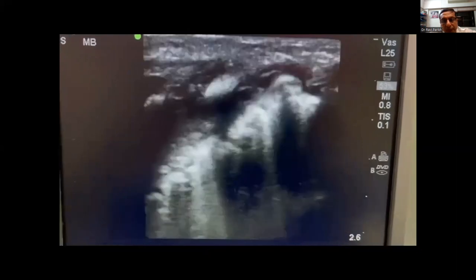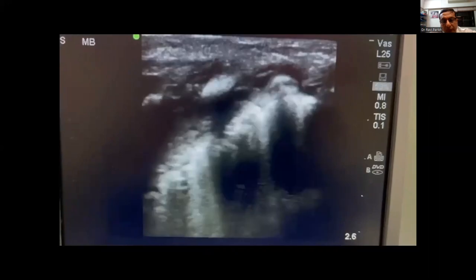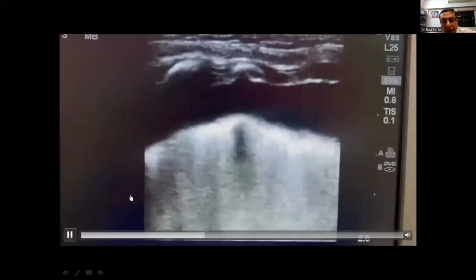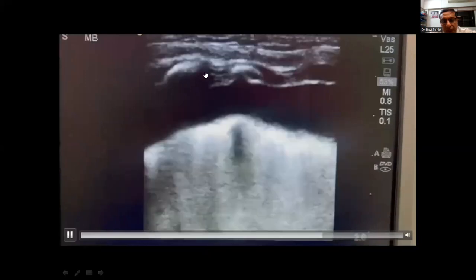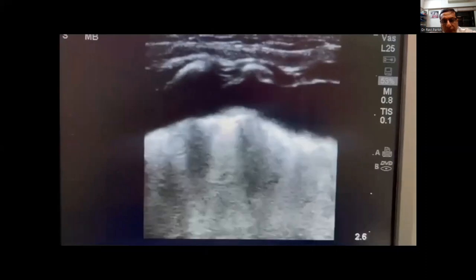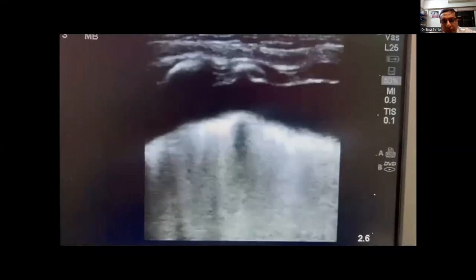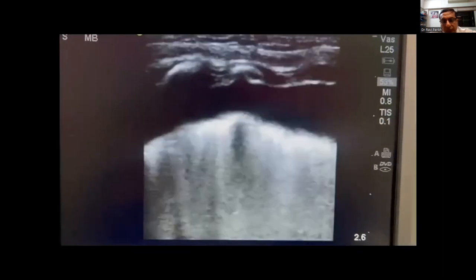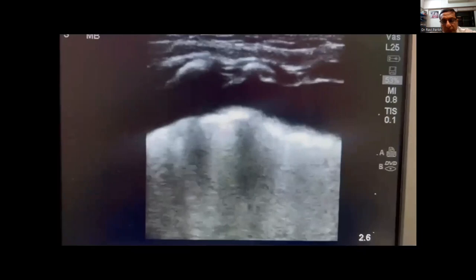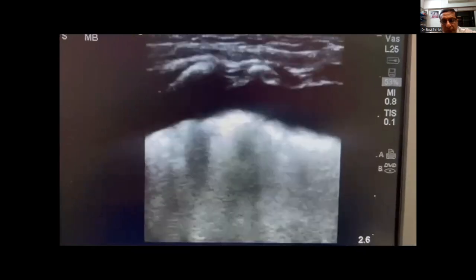I actually even wanted to know where exactly when we see that. I'll show you another picture. This was another area. I'm not very sure whether we should keep the probe like this, the way we otherwise keep it for our routine lung ultrasound scans, or it should be kept in a lower lateral area, the way we tell that the fluid settles down. So how do we actually keep the probe there? That is a whole session that we do. It's the second last session that we'll do.